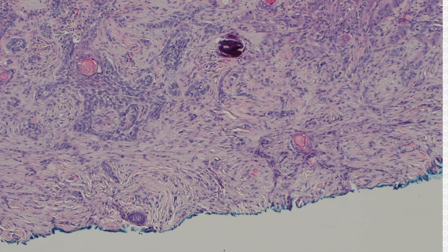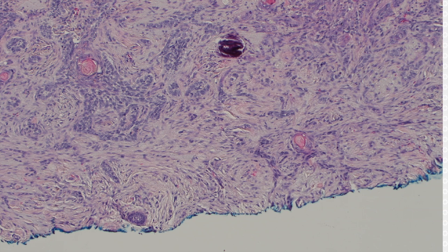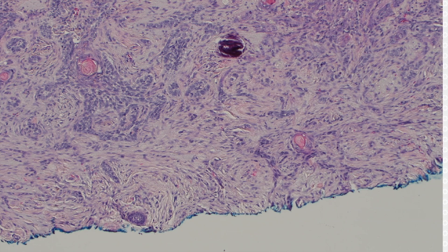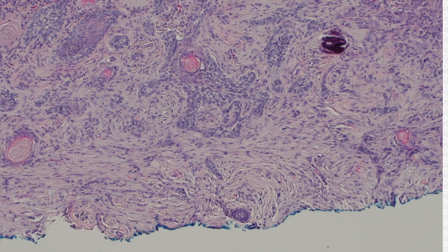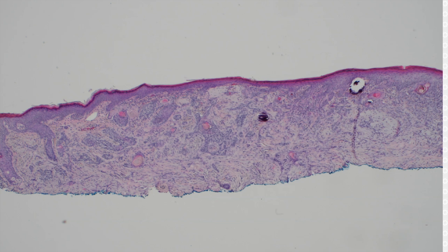It's a lot more spindle cells, and it's often kind of bluish with mucin mixed in. It's not as pink and dense — it's a little bit more bluish and busy stroma in infiltrative basals. So yeah, I would call that an infiltrative basal.